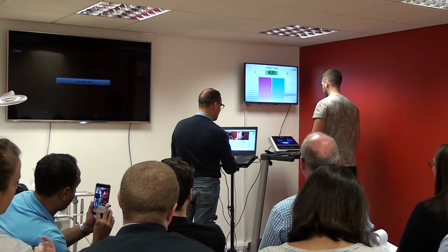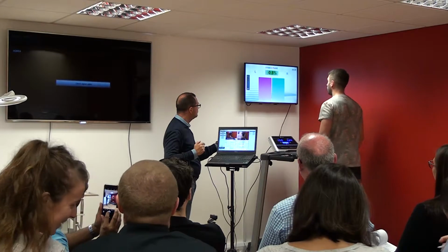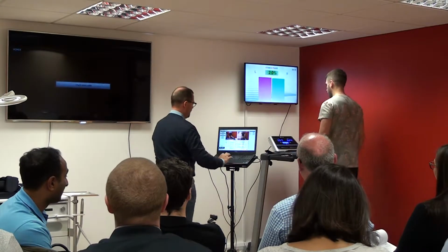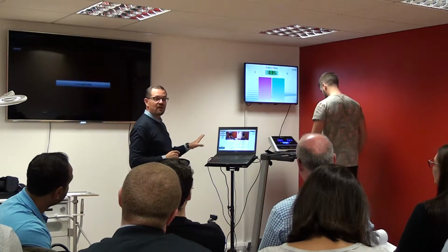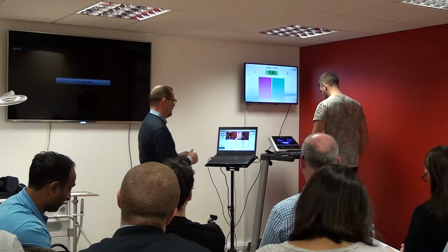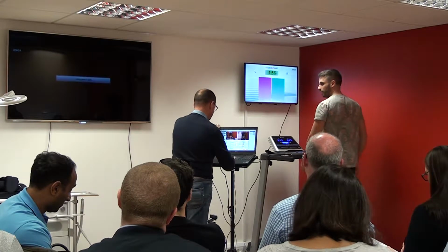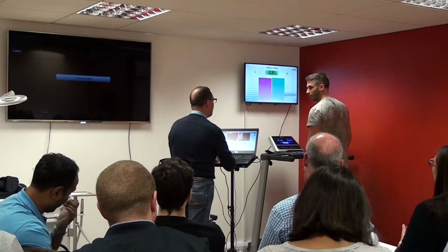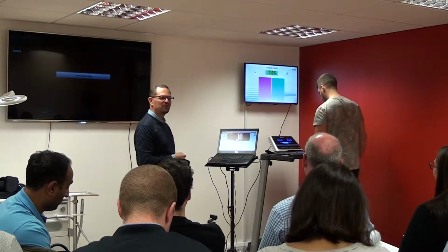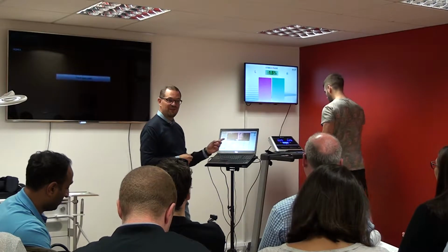keep the rhythm, okay? For example, okay, I can use the metronome function to say, okay, we wanna get a longer step. Okay, we reduce the pace. Not symmetrical to what it is in the speed that I'm doing it. No, you have to change the step length. Okay. See? Aha. Now it works. Yeah. And see what's going on. Okay.